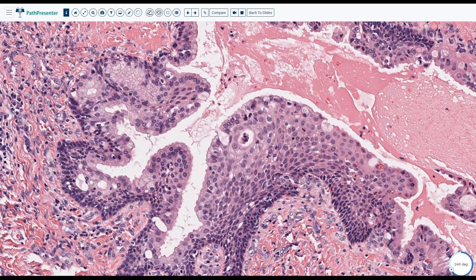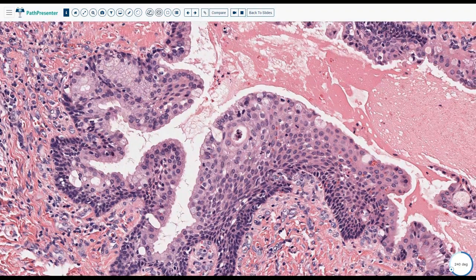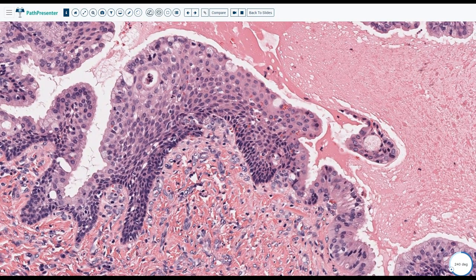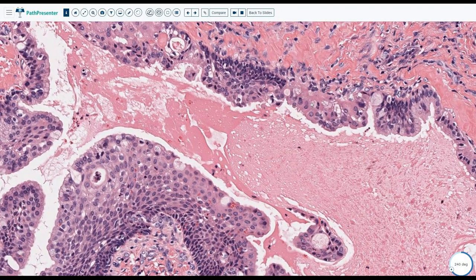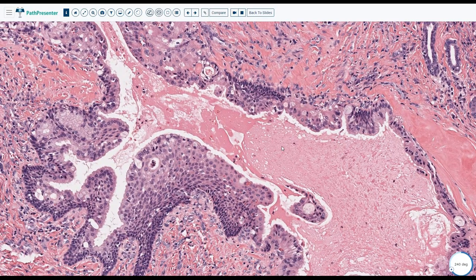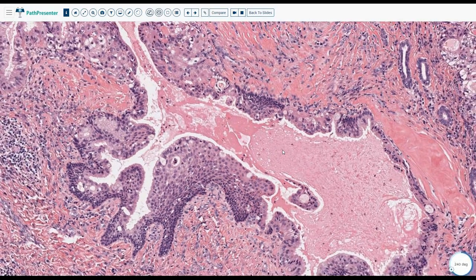Some of them here, like here, are the mucocyte or mucinous. Some of them are starting to change. They have some secretion, and they have a kind of polygonal form, so they are not epidermoid cells, not mucocytes.